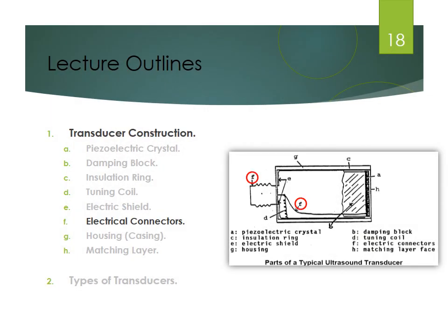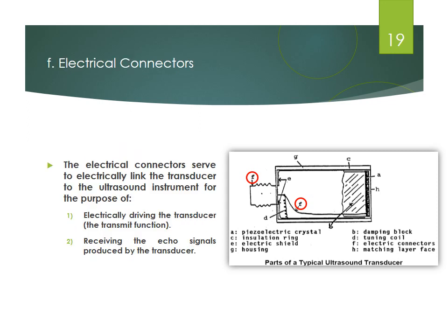The electrical connectors connect the transducer to the ultrasound instrument. It should be noted that the electrical connectors connect the transducer to the ultrasound instrument for two reasons, which are to power the transducer and receive the transducer's echo signals.